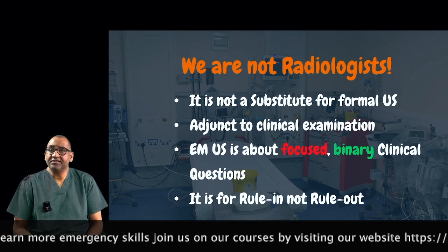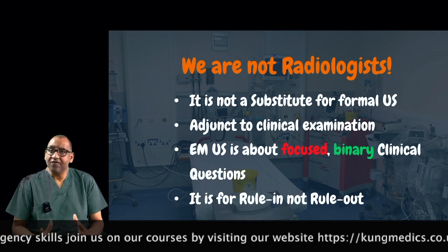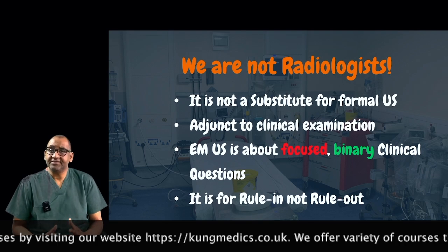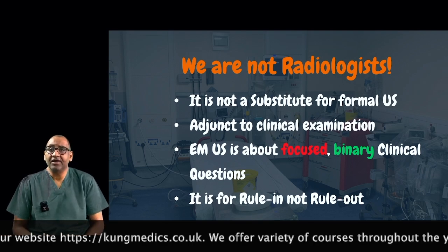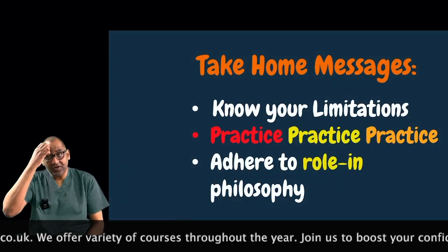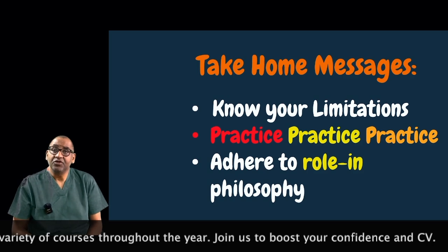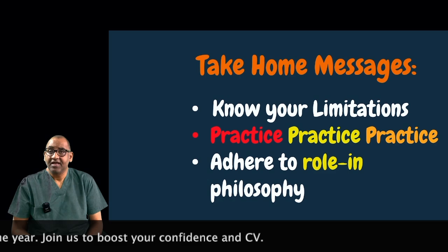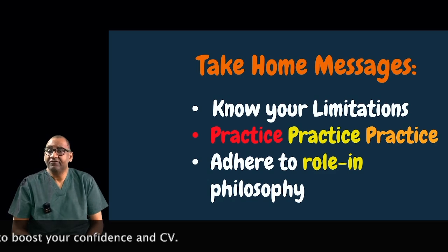Emergency ultrasound is about putting focused binary clinical questions. It is a rule-in, not a rule-out thing. So the take-home message is you need to know your limitations, practice, practice, practice, and adhere to the rule-in philosophy.